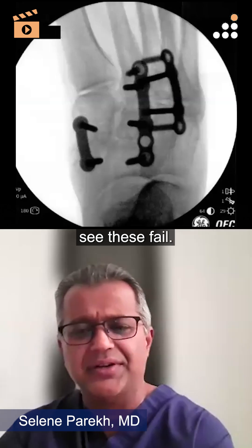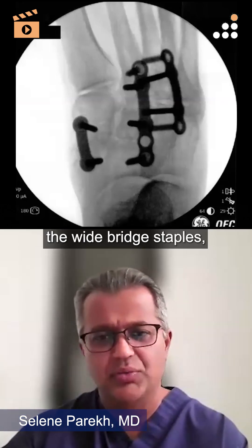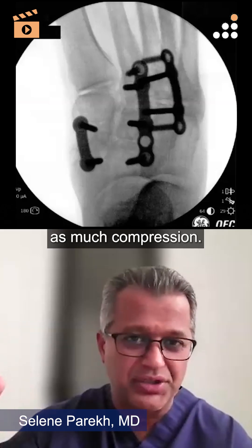You'd see these fail. Then I moved over time to more of the wide bridge staples, which gave a lot of strength, but then you didn't have as much compression.